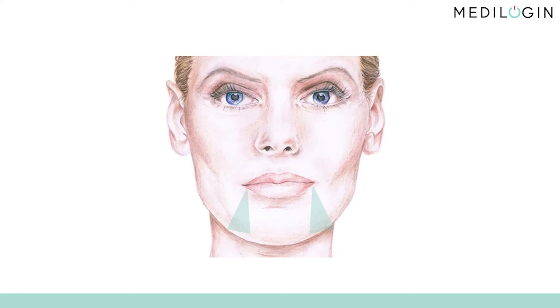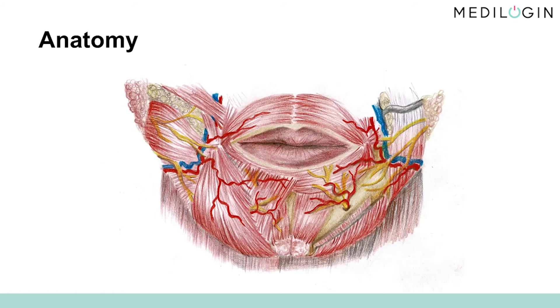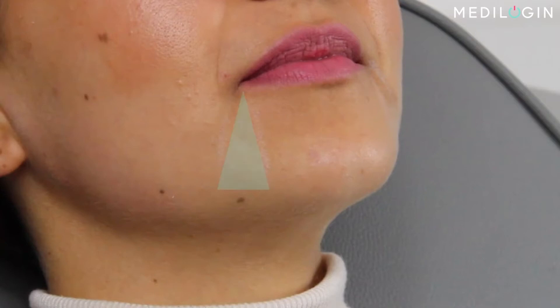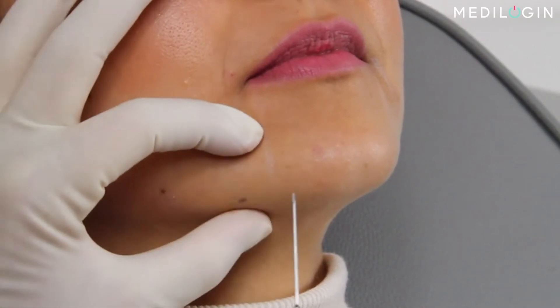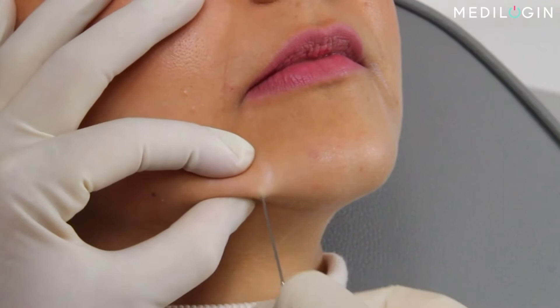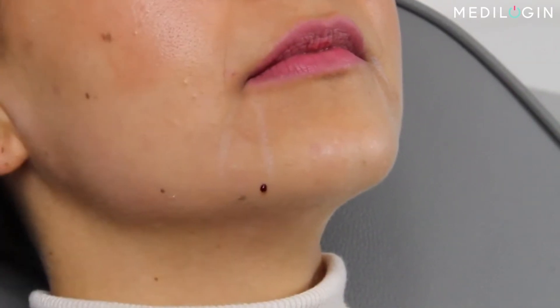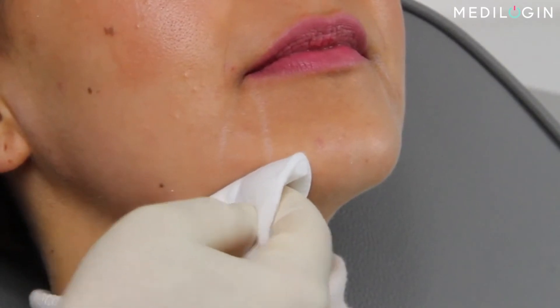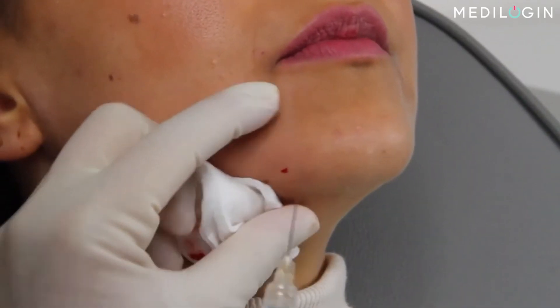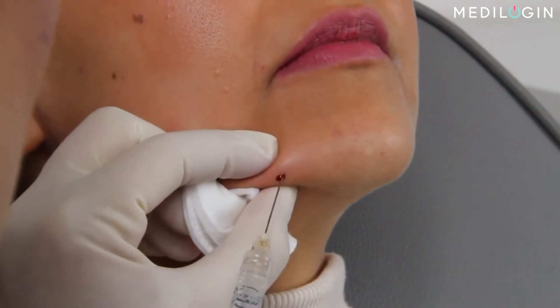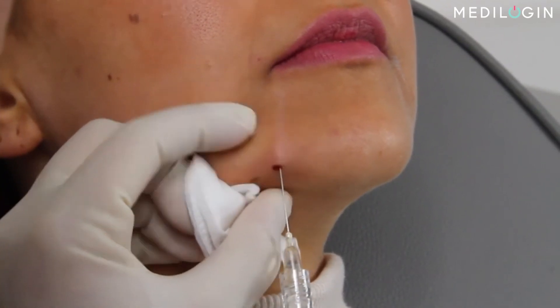In this lesson, we'll cover the treatment of so-called marionette lines using hyaluronic acid. Marionette lines are formed by the tension of various muscles. Starting at the corner of the mouth, draw two lines downward to create a triangle. Carefully disinfect the region with a wipe, and insert a sharp needle into the skin. Then take a blunt needle and carefully insert it along the previously drawn white line. A little resistance is normal.